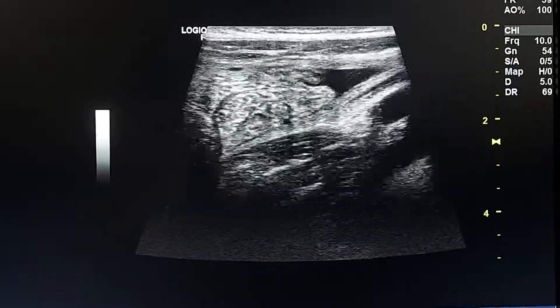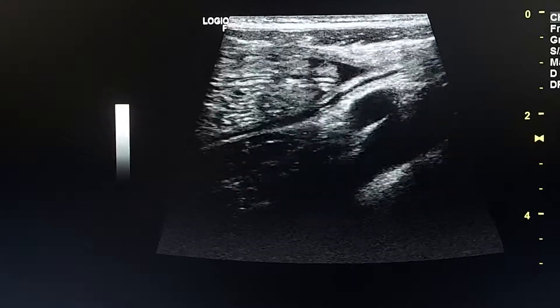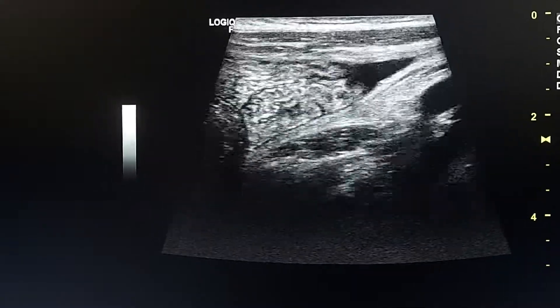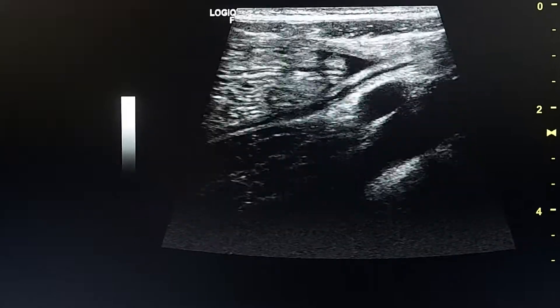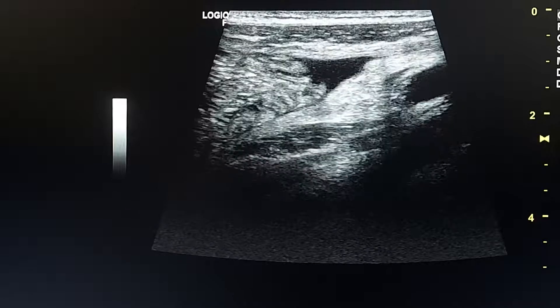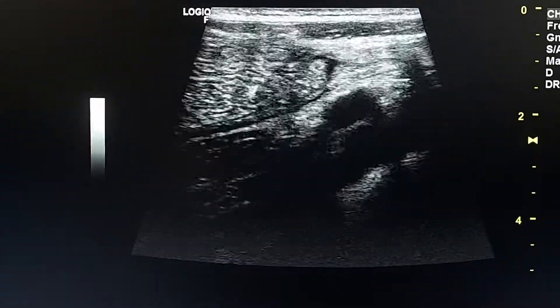This is a 12-year-old male child presenting with abdominal pain in the right lower quadrant, with Rovsing sign positive. Here we see a small amount of free fluid in the right lower quadrant.